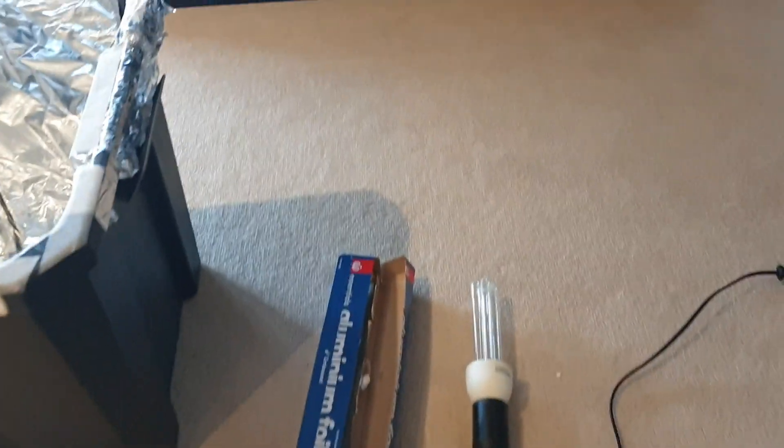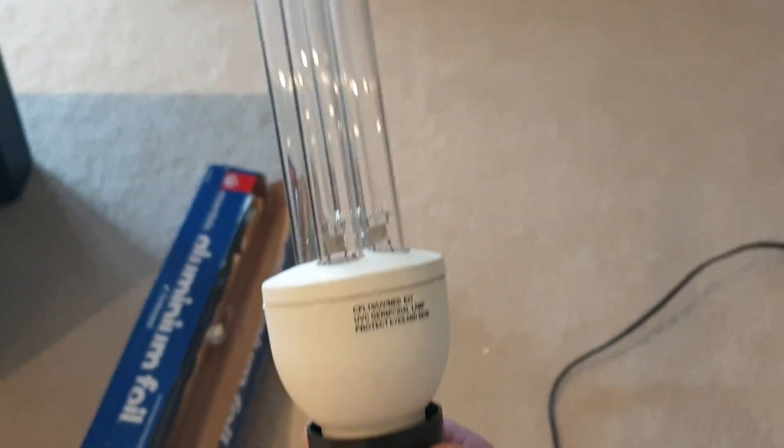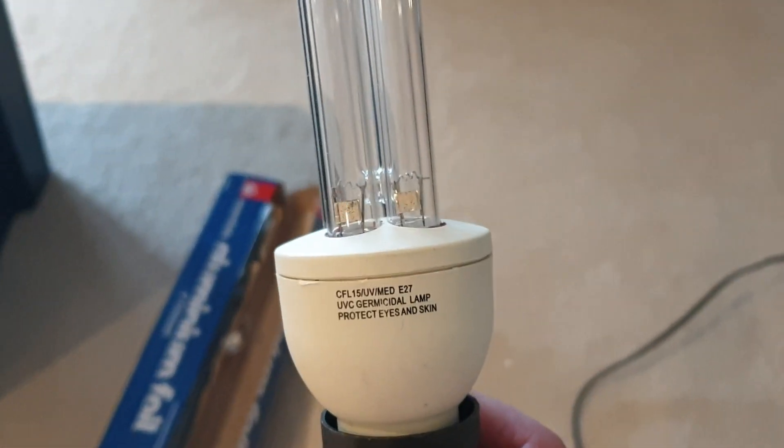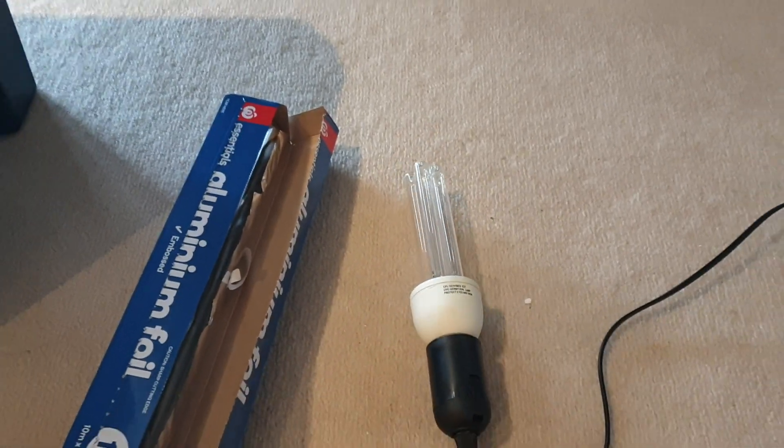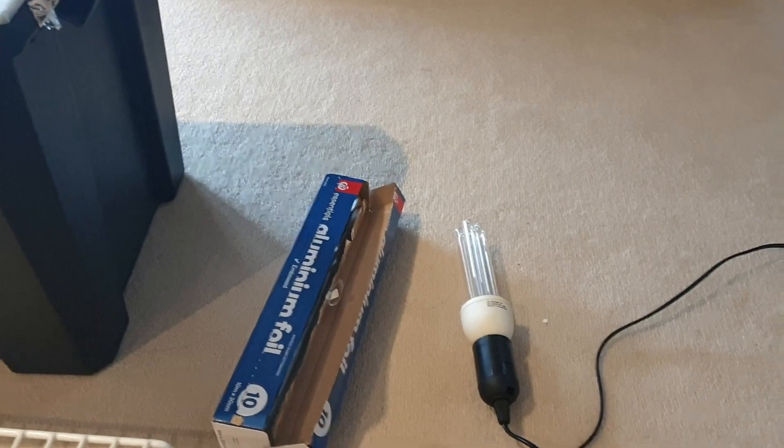The most important thing you have to get here, which might be kind of hard, is this — it's called a UVC light. This one's a 15-watt version. It's used to sterilize medical equipment. I bought it here in Australia on eBay for about $35.